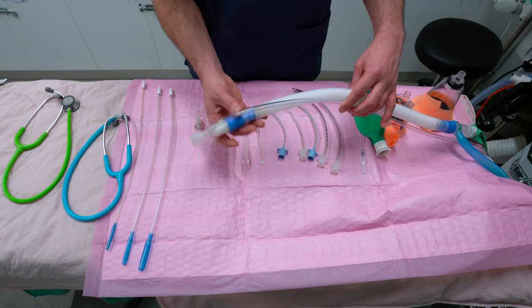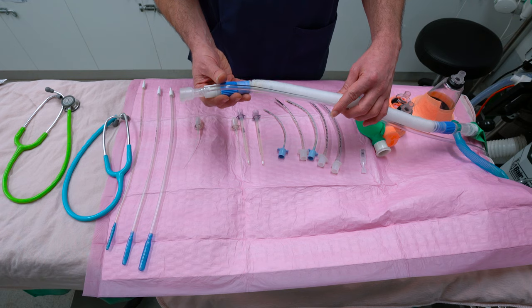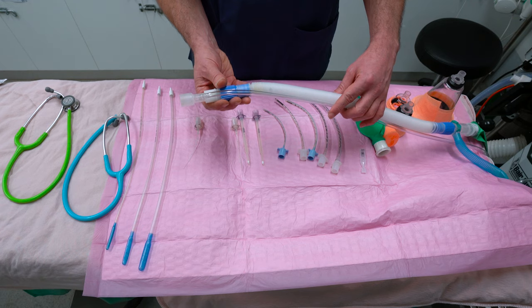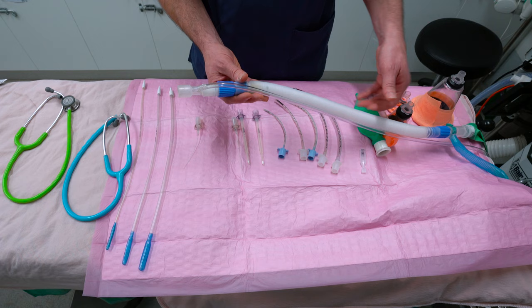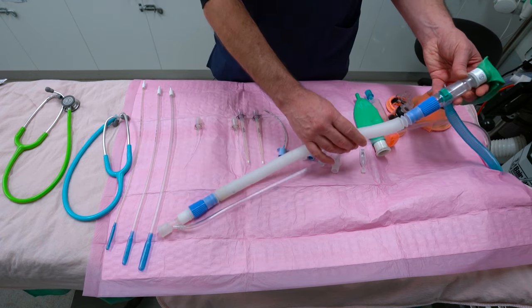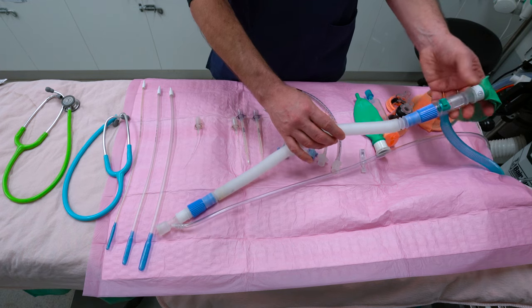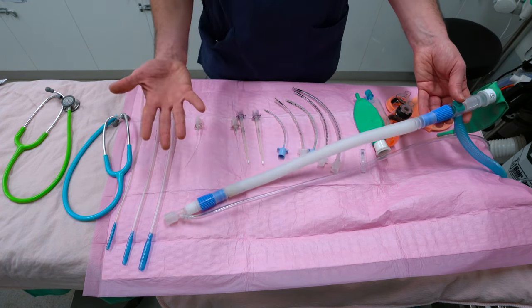Once we have the bird contained, we will anesthetize with isoflurane. We have a modified Jackson-Reese circuit here, but any small animal open circuit will be suitable for birds — a circuit where we can open and close the valve and perform IPPV on the bird. Most circuits you will be able to do that.